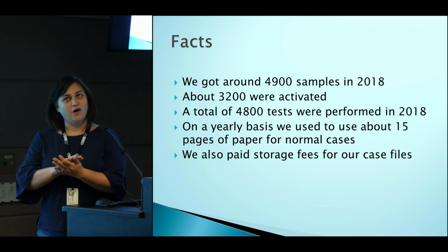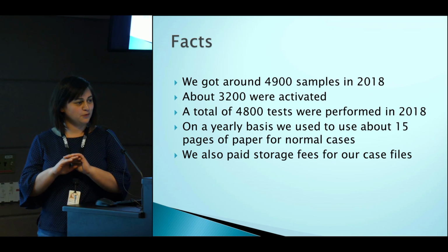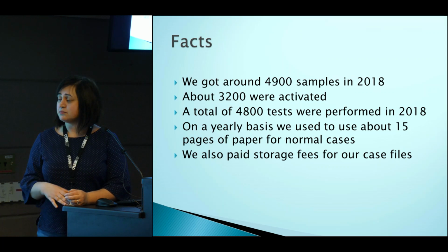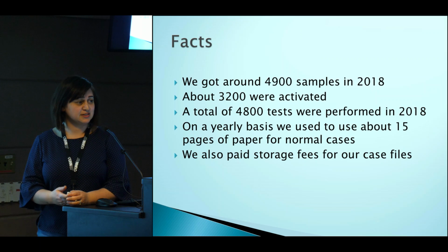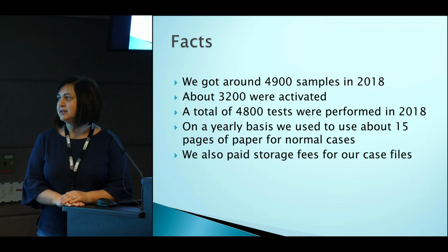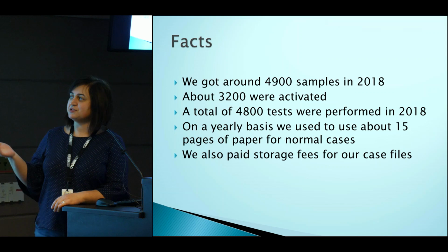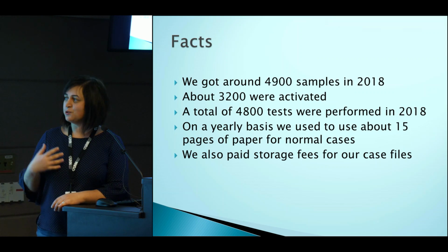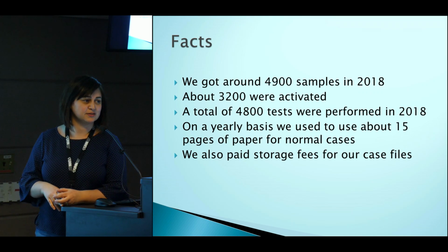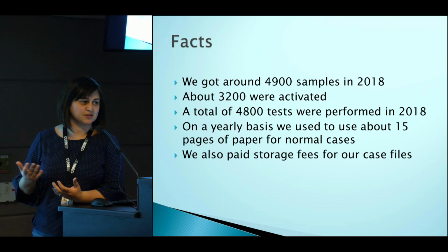All samples go through logging in, accessioning, culturing and harvesting, but only the activated ones go further in terms of slide making, scanning, capturing, and analysis at the end. About 3,200 of these cases were activated, but in total we did 4,800 tests. These tests can be a combination of cytogenetics, karyotyping, as well as FISH.